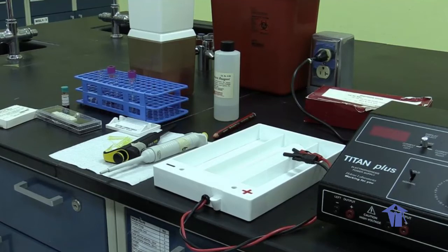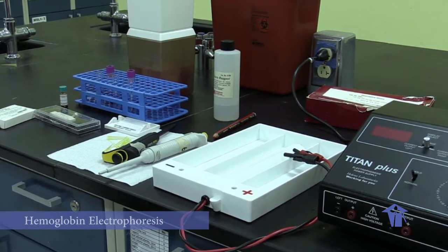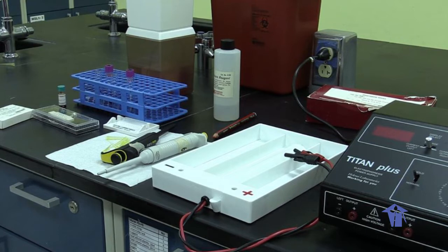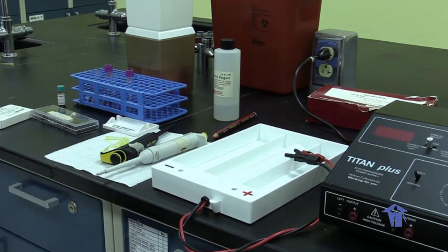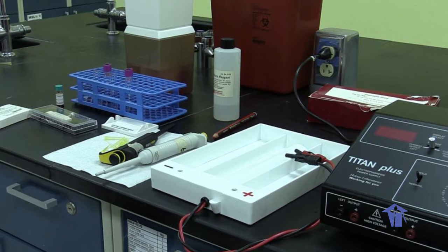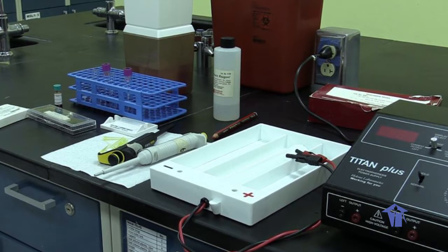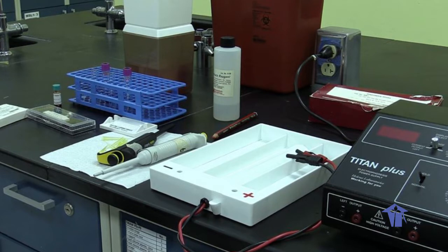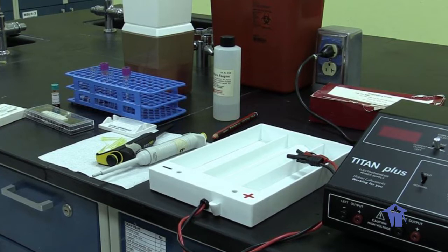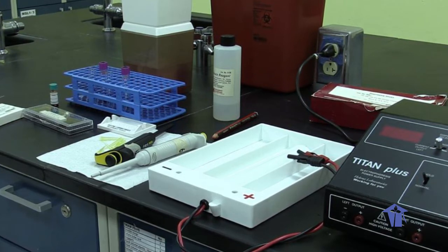This is Laboratory 9 that deals with hemoglobin electrophoresis, and the objective is really to allow the students to become familiar with the technique of hemoglobin electrophoresis, which is a laboratory test that usually measures hemoglobin molecules and their variants in the blood, because there are several types of hemoglobin that are present normally in the adult, and there are variants to these, and we use electrophoresis to determine what variants are present that may be causing disease, for example, like sickle cell anemia and so on.